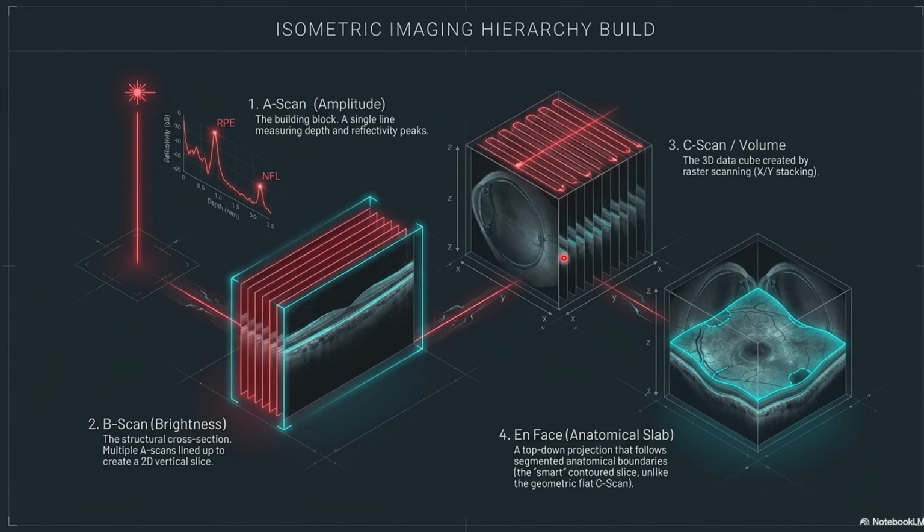However, in the OCT, the software makes a modification respecting the concavity of the posterior pole. You can see the concavity, so this is named as segmentation, or an anatomical slab. So the C scan is three-dimensional data, but taken horizontally at an exact level. So it is not suitable for the eye. It is used in physics more than in the eye.